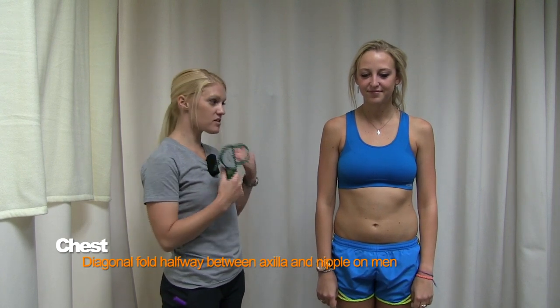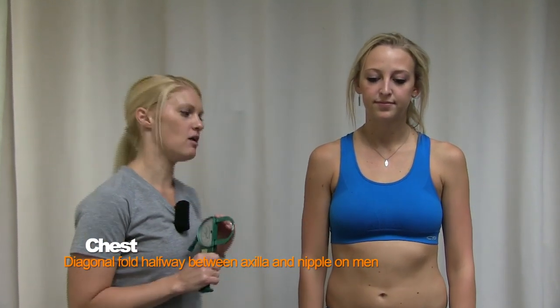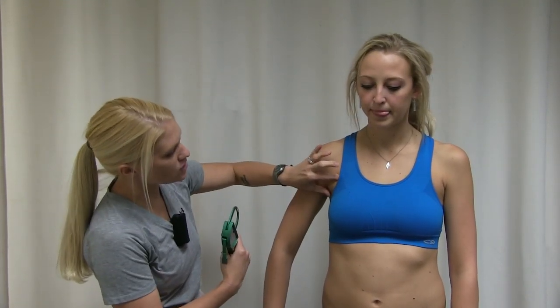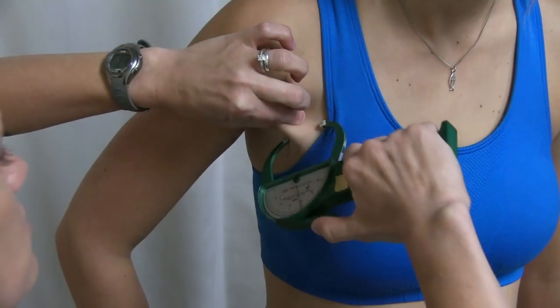The next measurement is the chest, which is also a diagonal fold and the only one that varies between males and females. For males, go halfway between the nipple and the armpit crease. For females, go about a third of the way, closer toward the armpit — you can typically just eyeball this. A sports bra may be in the way, so let your subject know where you're measuring. It's a diagonal fold pulling the skin and subcutaneous fat away from the muscle.